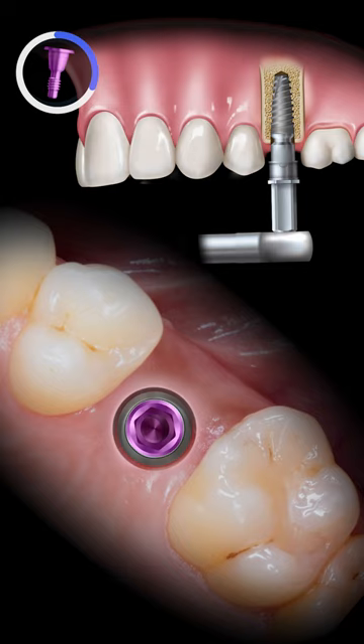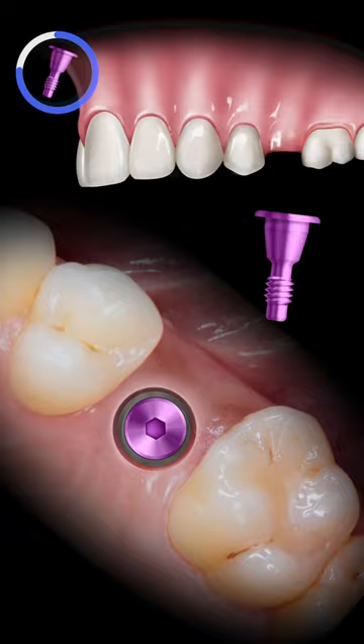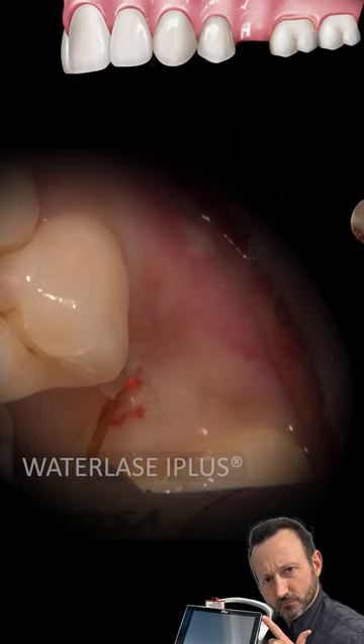At previous visits, the patient's non-restorable tooth number 13 was extracted and a HON tapered implant was placed. At the time of surgery, it was decided to place a cover screw, allowing the soft tissue to heal over the implant site.